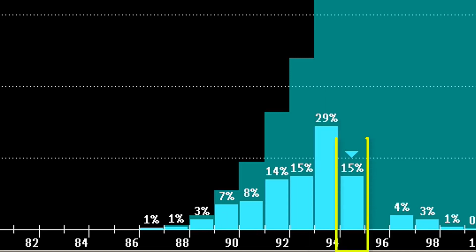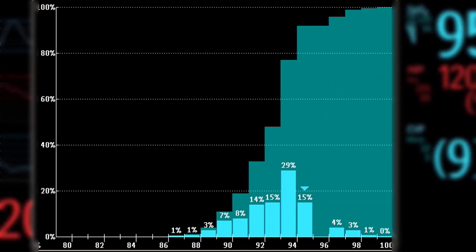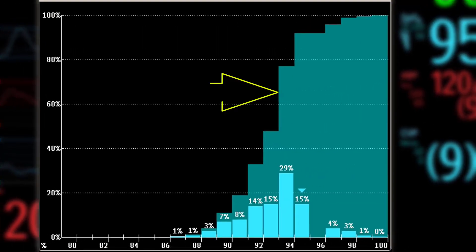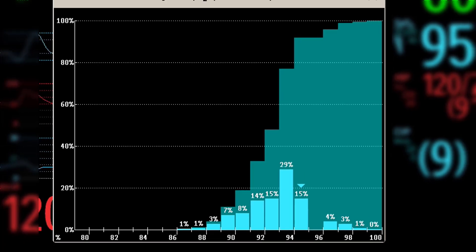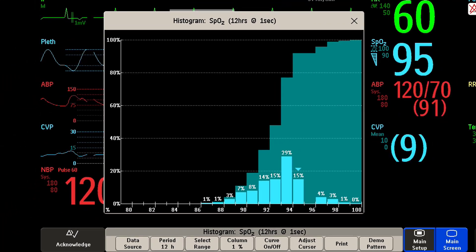The arrow mark over a column shows that the currently measured value is in this range. The columns in the background show the cumulative percentage value. You can switch the cumulative columns off using the pop-up key Curve On or Off.